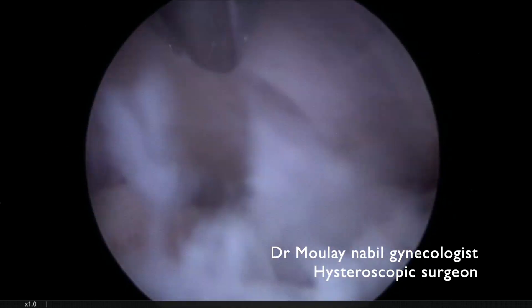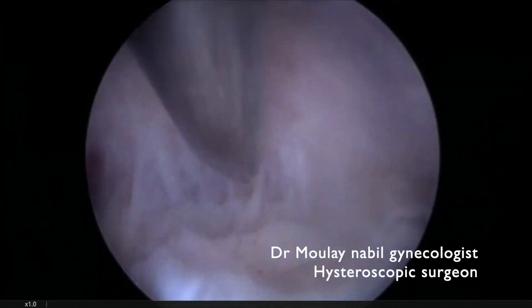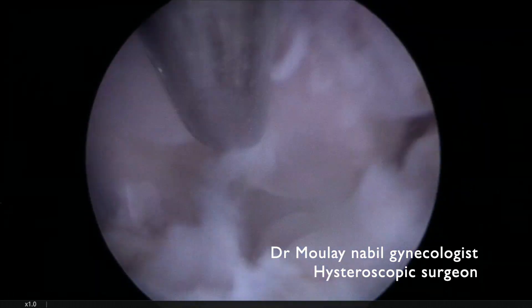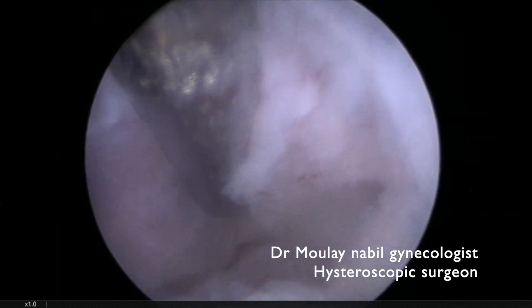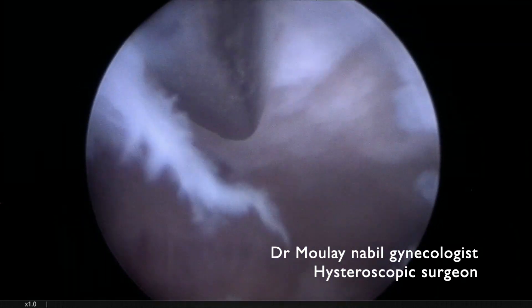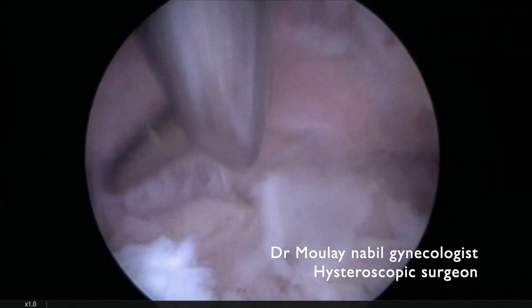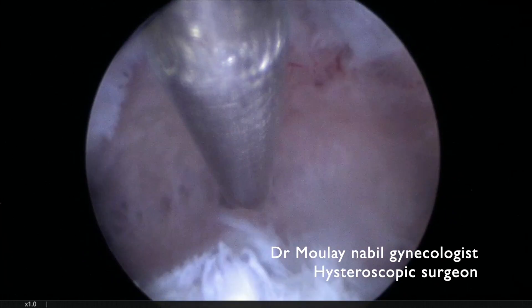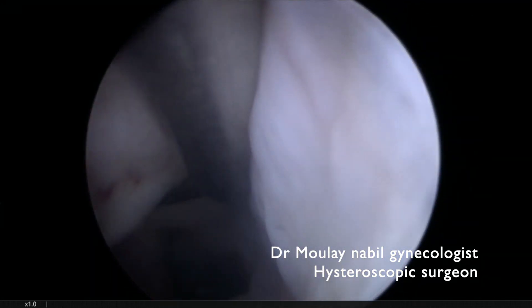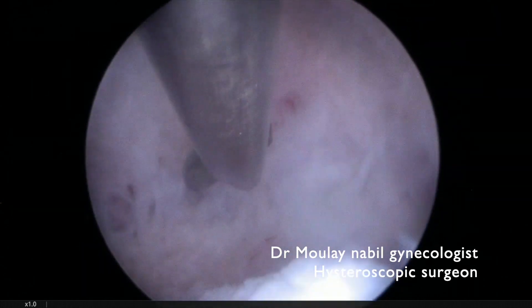You can cut the fundus. It is mandatory to do a diagnostic hysteroscopy two months after the procedure to see the final anatomical results. We cut now the fundus, and we can appreciate the uterine cavity volume after this metroplasty.